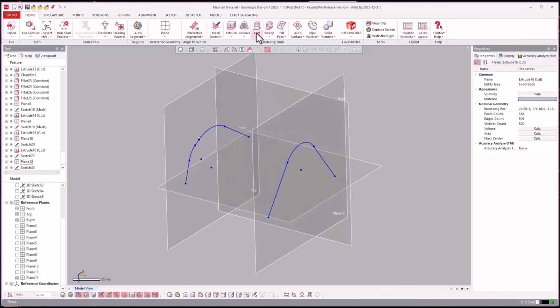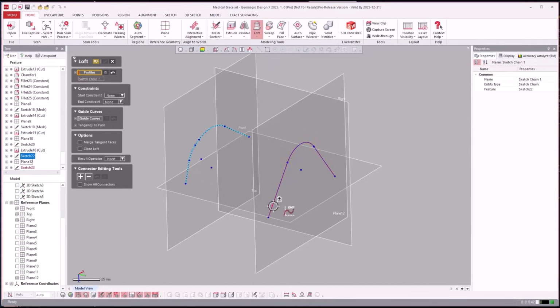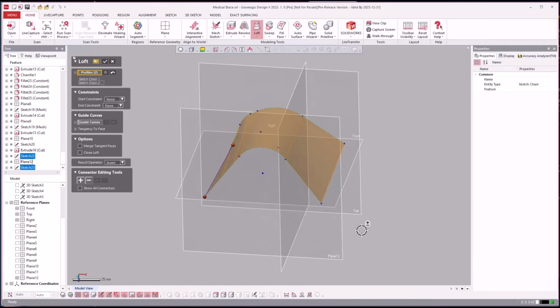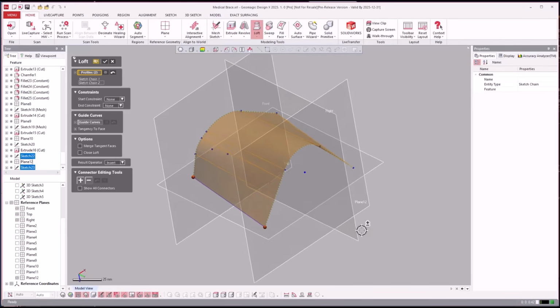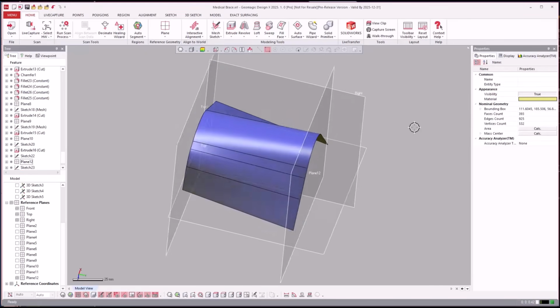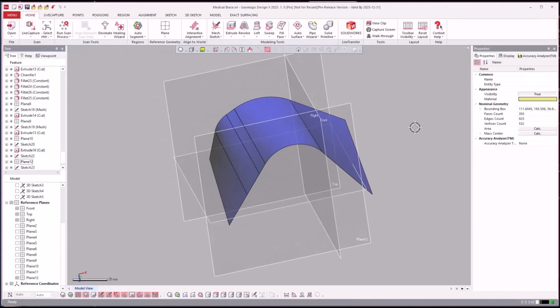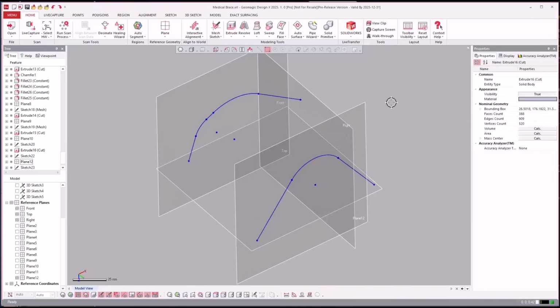And now, if you go to loft these, anybody that's done some lofting, you see that it's not too bad. In this instance, it's going to do a reasonable job. But sometimes the line segments don't match up well to loft and make a nice clean loft. So we'll go ahead and accept this. And this is an okay one. I could have made it a messier loft by doing more segments and less segments on each side and not having them translate over well. So we'll go ahead and undo that.